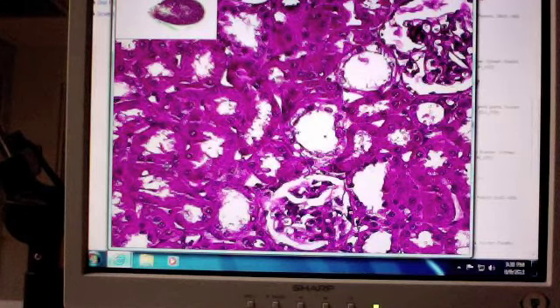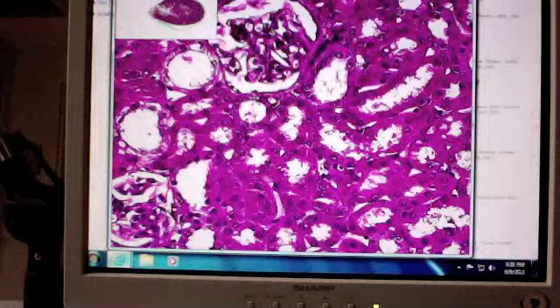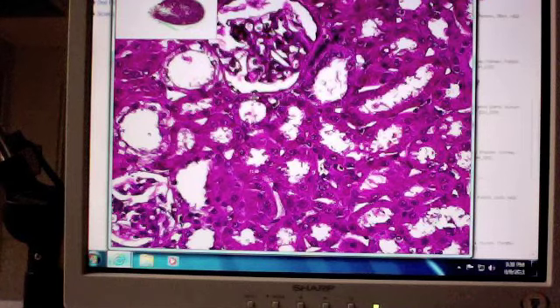So when I ask questions, what I would do is put the arrow here, and I would then say this is a nucleus of what kind of cell? You want to answer? It's a cell of a simple squamous epithelium, okay? Or a simple squamous epithelial cell.